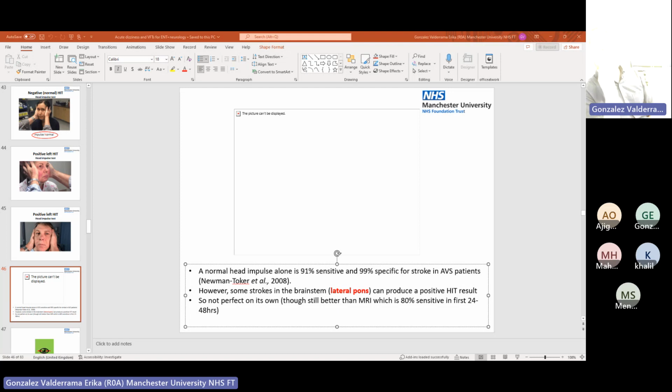When you diagnose people with vestibular neuritis, you don't necessarily need to know which ear it is, although the head impulse hopefully will tell you. But usually it beats towards the healthy ear. So if it's flicking to the left, you know that the problem's probably on the right with vestibular type nystagmus. Now this is a cerebellar stroke, I think.